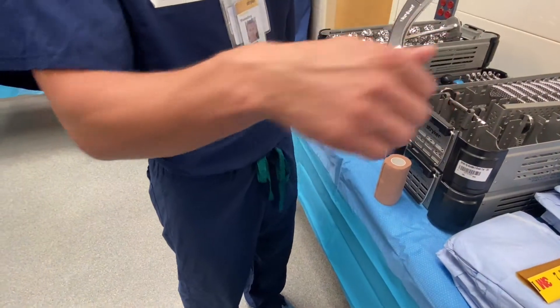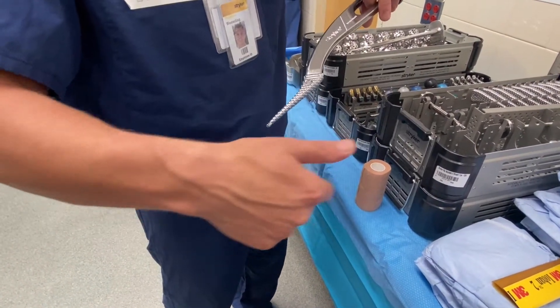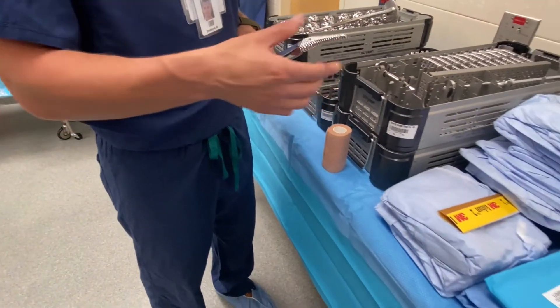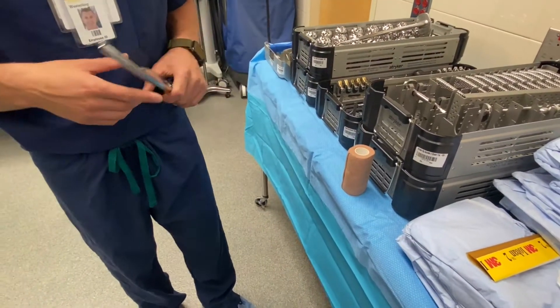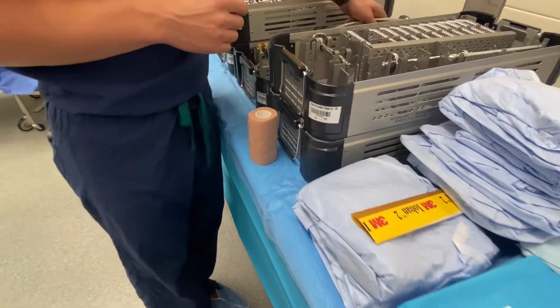One thing to note: these broaches are really sharp, so you don't want to change them out with your bare hands. It's best to use a lap — you're cleaning them at the same time and protecting your gloves so you don't get a hole in them. Sometimes laps tend to be a little frail, so I even use the blue towel — it's a little tougher so you'll really get a good clean with it.